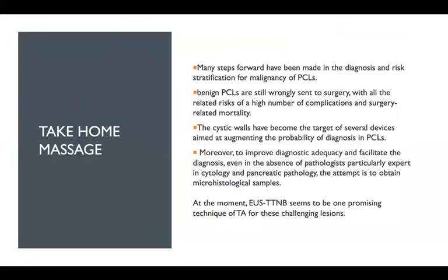Take home message. Many steps have been taken forward for the diagnosis of pancreatic cystic lesions and stratification of malignancy. Also, benign pancreatic cystic lesions are still being sent to surgery with all the related risk of a high number of complications and surgery-related mortality. So, the cystic walls have become the target of several devices aimed at augmenting the probability of diagnosis of pancreatic cystic lesions.